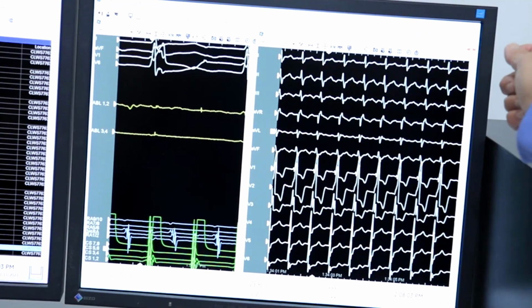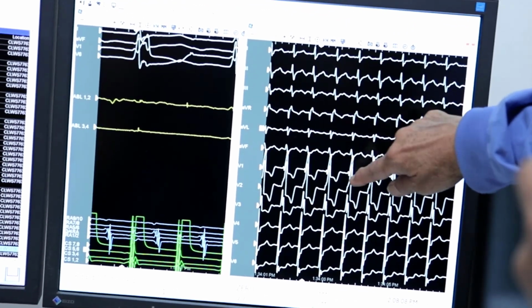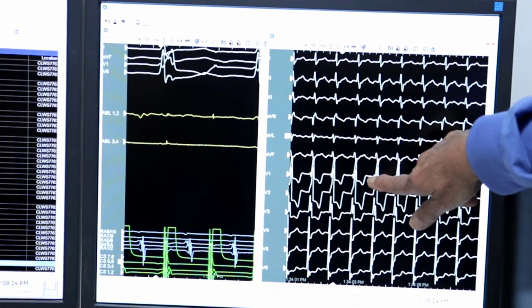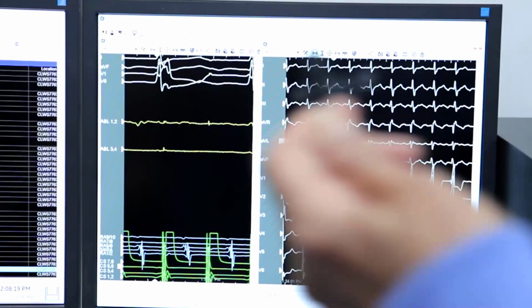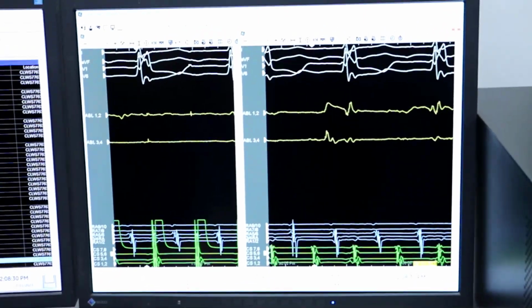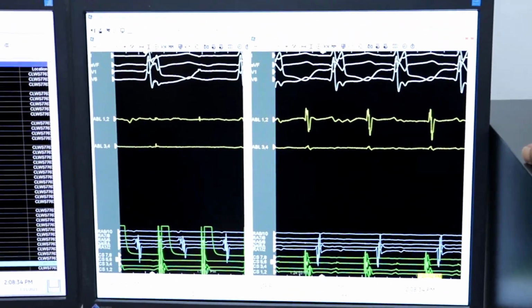Which I ablated in 2008. It is negative in II, III, and aVF, and almost flat, or maybe positive, in V1, but because he has a diseased right atrium, you cannot expect the P wave to be that good. Okay. Flutter cycle length is 320. The cycle length of the flutter is 320 or 330, so it's a slow flutter because of previous ablations and a diseased right atrium.